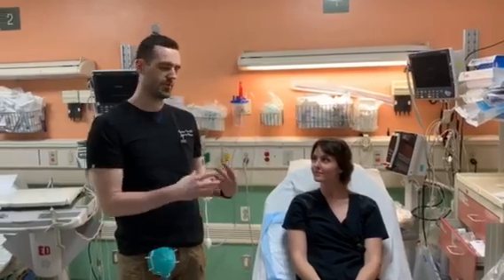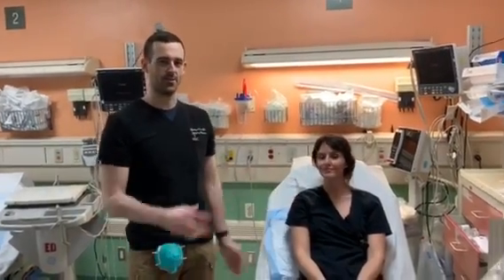I'm going to show you how to set up the pre-oxygenation mask we're going to use for COVID patients. Lisa is going to be our COVID patient for today. This is only for people who need pre-oxygenation before intubation — not for regular BiPAP or CPAP patients. We do have viral filters; we use those separately. This is only for pre-oxygenating before you intubate.